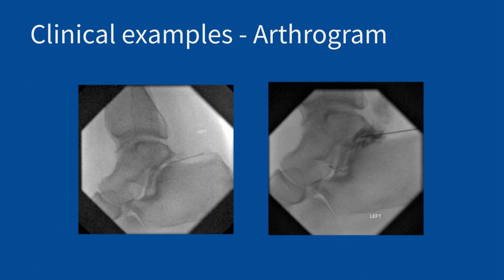As you start going to the smaller joints, it becomes more and more difficult to inject these under anatomic landmark guidance. And so people more frequently use fluoroscopy. And the other thing you can do is actually use ultrasound. So it is possible to inject joints under ultrasound only without needing any fluoroscopy, including the smaller joints. But technique requires some practice there.